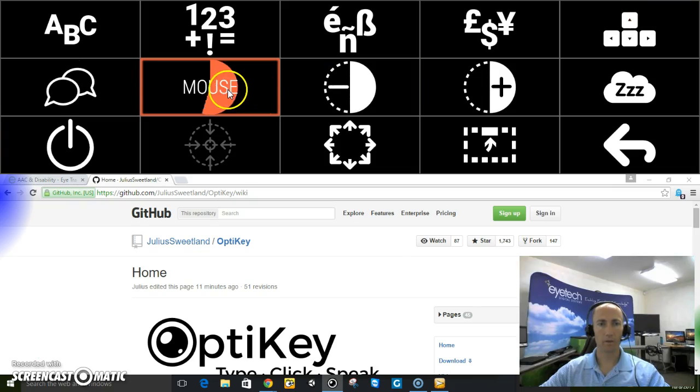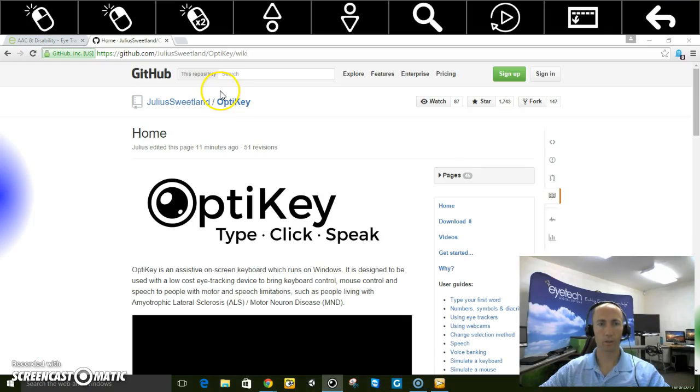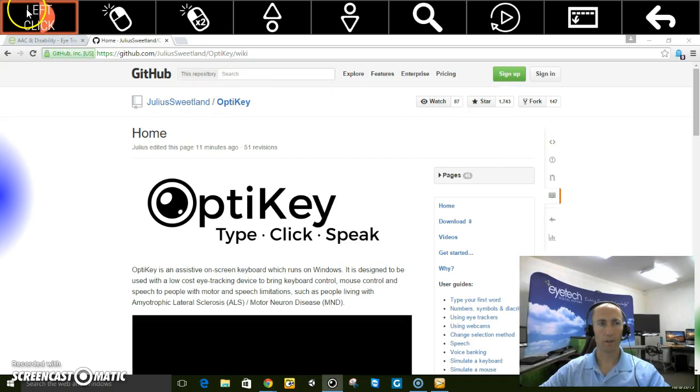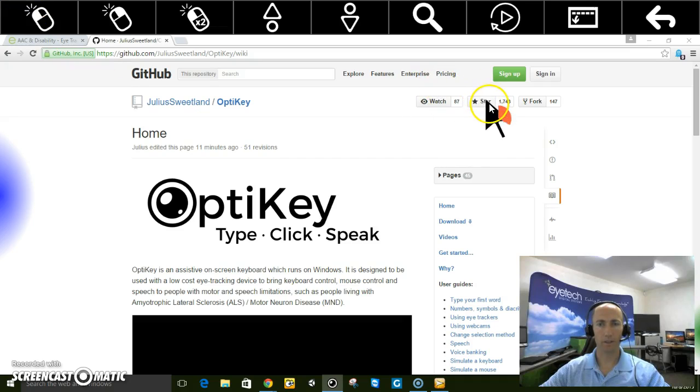And go to my mouse control. It has your left click. So say I wanted to star this page. I can go ahead and look at the left click and select the star.